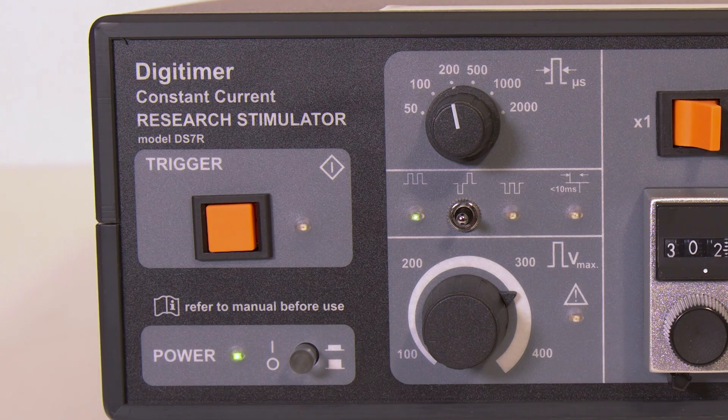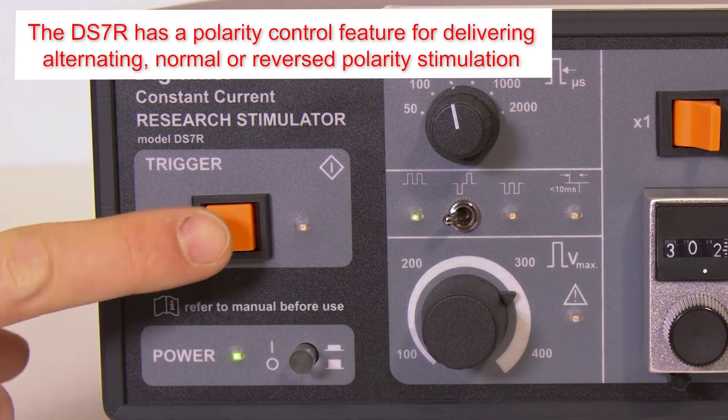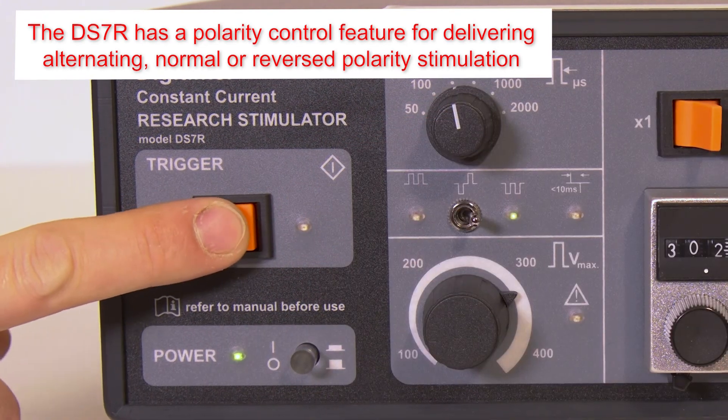The DS7R has a polarity control that permits the user to set the stimulator to alternating, normal, or reversed polarity via a 3-position toggle switch.